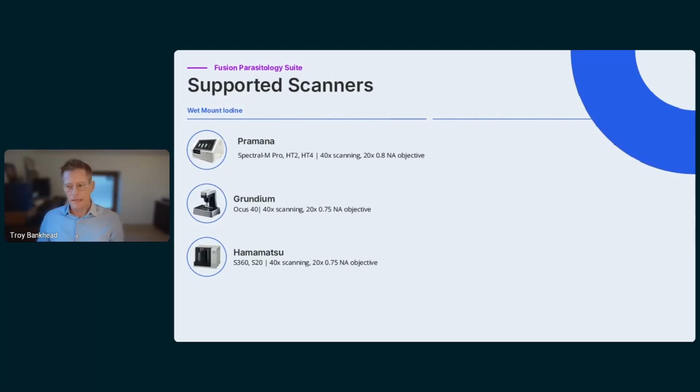And when we say validating scanners, there are many steps involved in this. It's not just a question of purchasing a scanner, hooking it up, and having it go. With liquid-based samples, in fact, if you were fortunate enough to view one of our previous webinar episodes last year, we had an episode on the intricacies and difficulties in scanning sparse and liquid-based samples, where we go over in more detail some of these points.